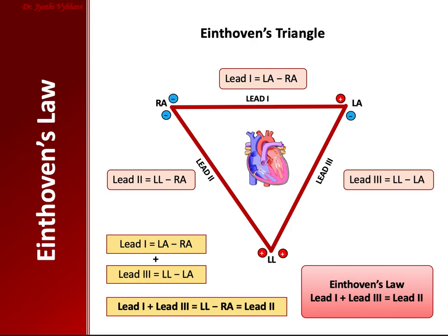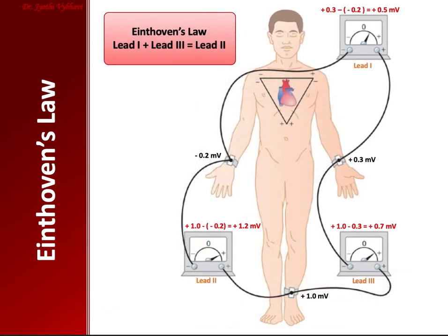It's very easily Mr. Einthoven has done all this. Okay. Now that we have understood what is Einthoven's triangle and what is Einthoven's law, let's take an example and find out whether it is true or what. Okay. So let me state intervals in a different way.